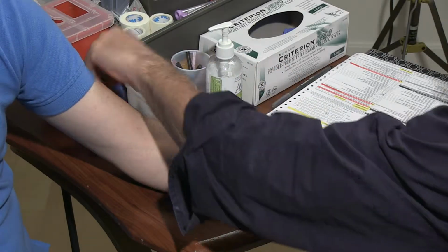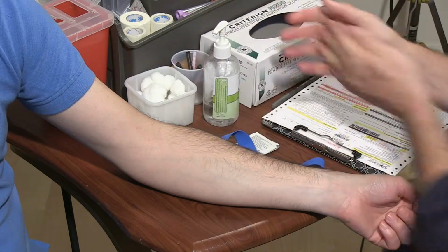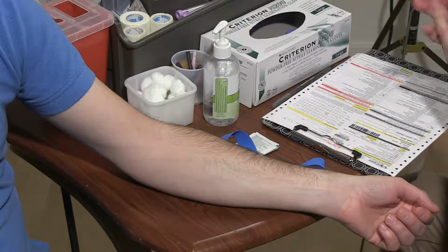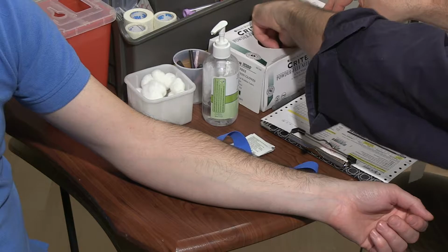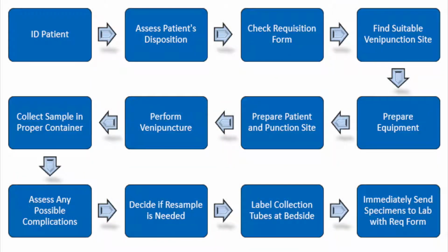The student will introduce him or herself and his or her role as a medical assistant. The student should also identify and introduce the clinical supervisor present for this invasive procedure. The student will explain the purpose of phlebotomy to the patient and the steps involved. As part of the initial introduction, the student should confirm the patient or model's understanding of the procedure and elicit their verbal consent to proceed.